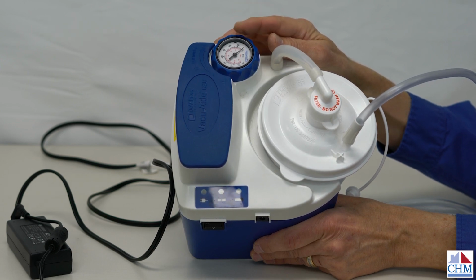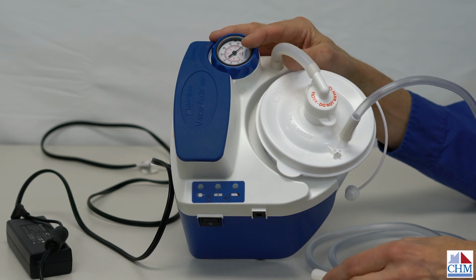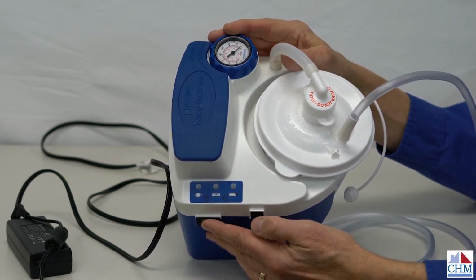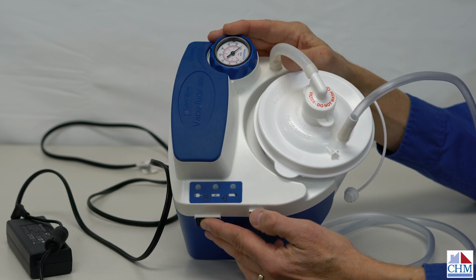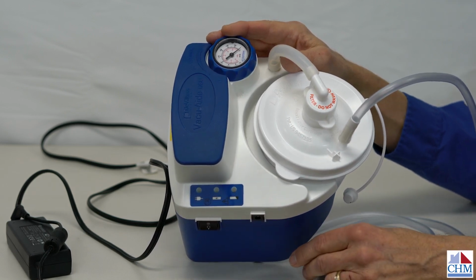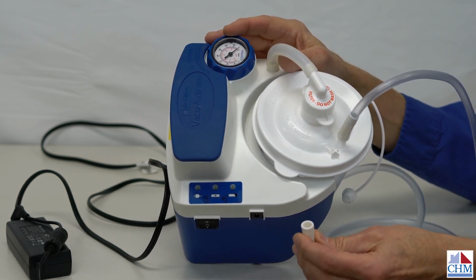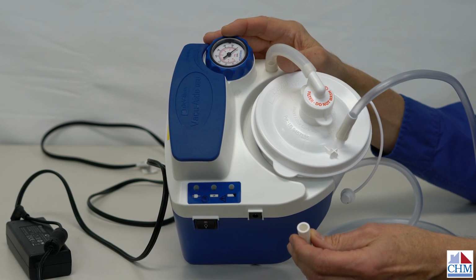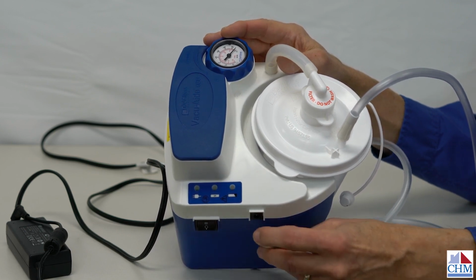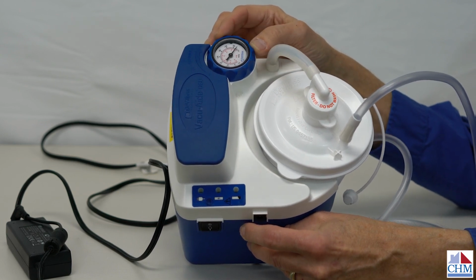So to adjust that pressure, what we'll do is go ahead and turn the machine on. This is a good thing to check on the machine from time to time because they do get turned up inadvertently sometimes. But start the machine, and the first thing you notice is that there's no suction indicated without having the tubing connected. So know that, and then when we connect it, or when we occlude the end of the tube, you can see that the suction pressure is shown.